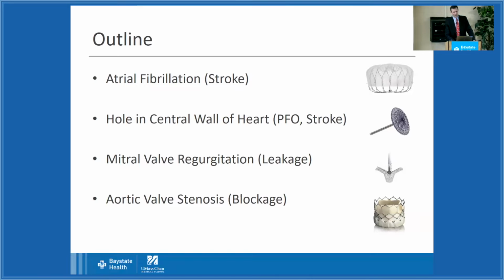Then we're going to talk about a hole in the septal wall of the heart. That's called a PFO, or patent foramen ovale. That can also be a source of stroke, and that's something we can close without surgery, again, in a minimally invasive procedure. Now, mitral valve regurgitation, that's a leakage of the mitral valve. Again, something that historically had required surgery. We can treat that with a catheter-based, minimally invasive procedure.